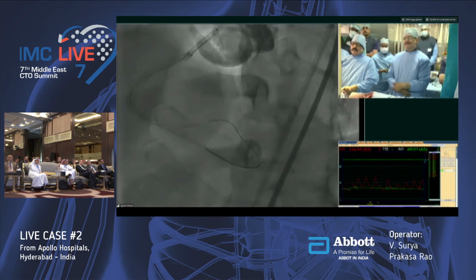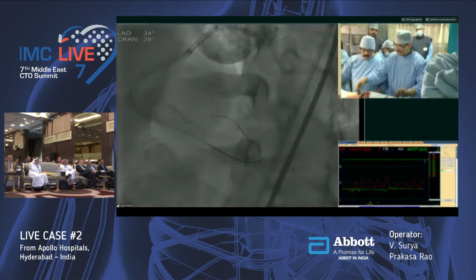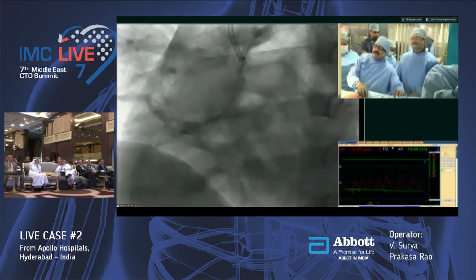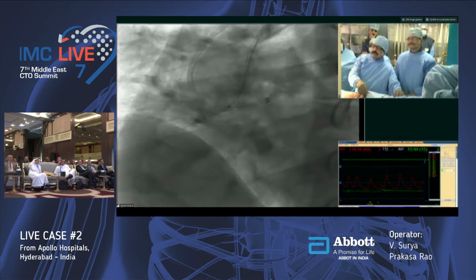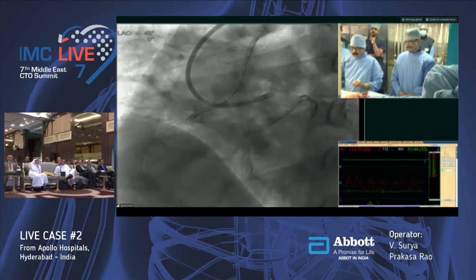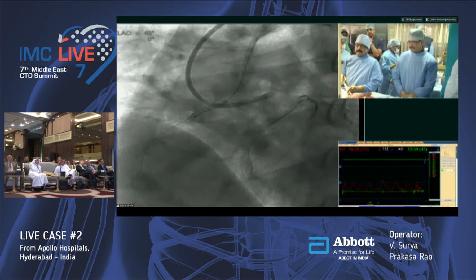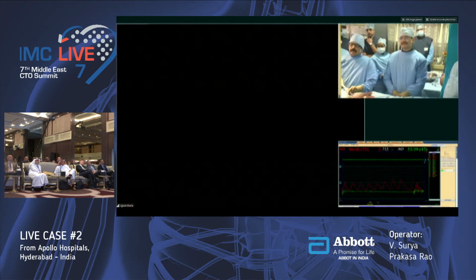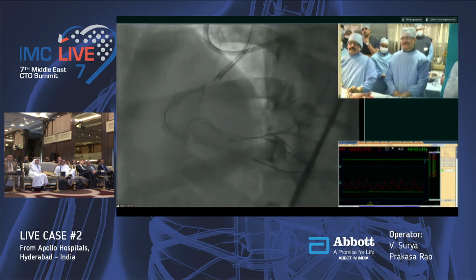Engage the guide. Okay. ACT, please check. Yes, it is in that position. It is in the PLV. Yeah, perfect.